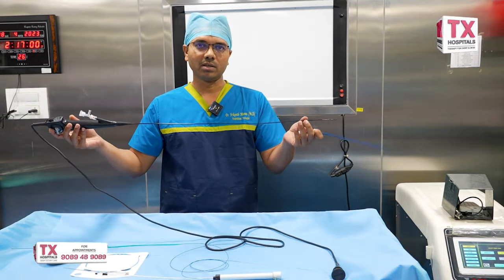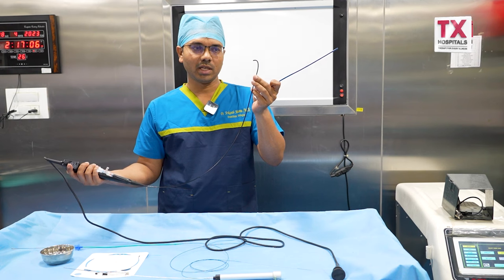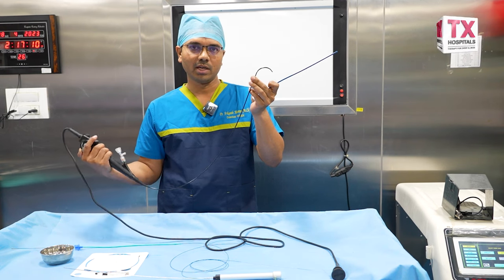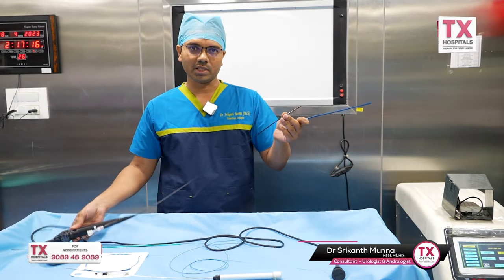This procedure's main instrumentation involves the scope. We use the tip — the scope has a bend. The kidney stone is reached by adjusting the angle and rotating to the right bend. We use the scope for clear vision, with normal saline irrigation for the kidney.